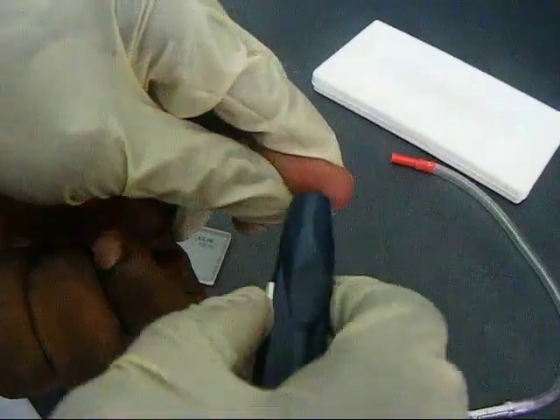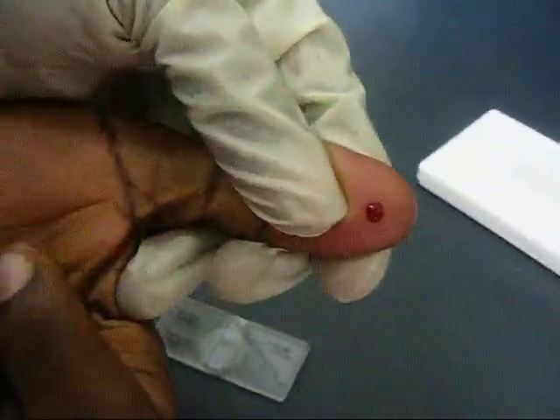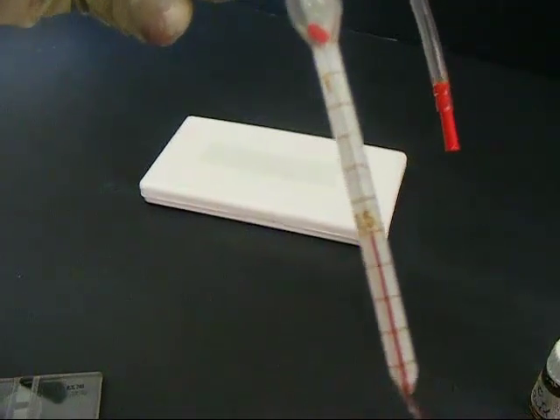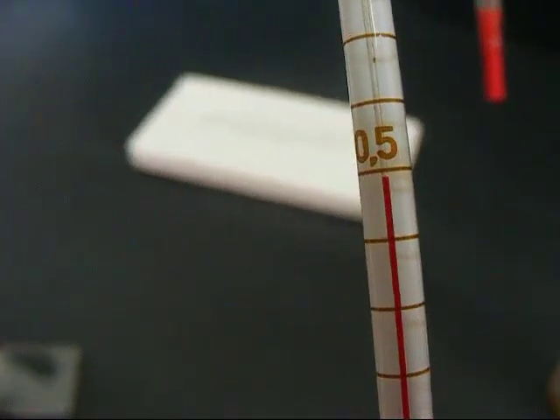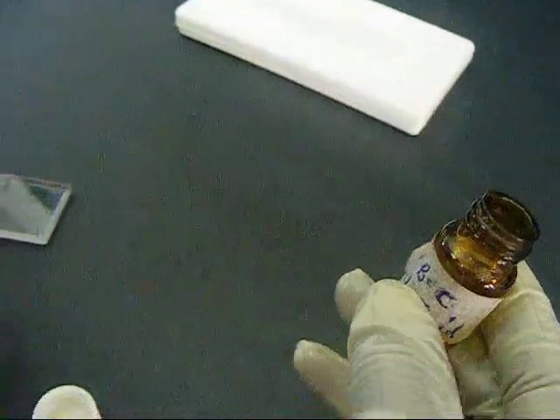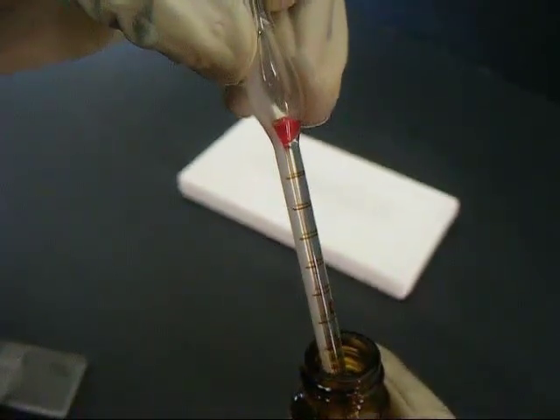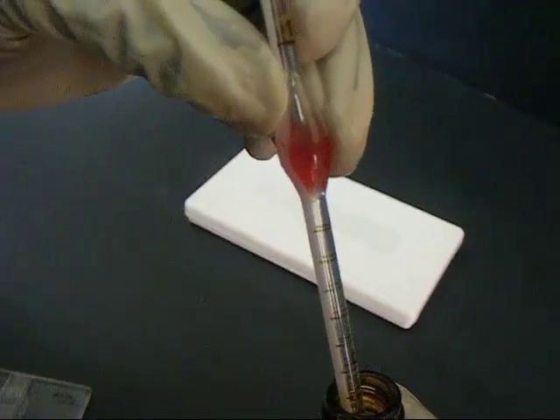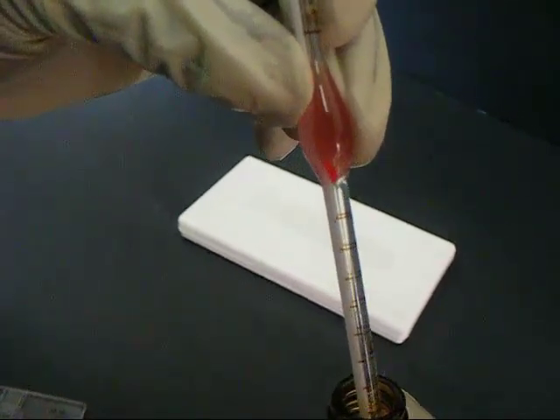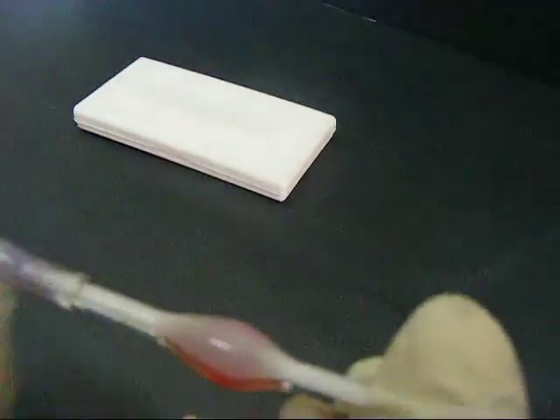The lancet is used to prick the tip of the thumb and the blood is pipetted with a red blood cell pipette and filled to the 0.5 mark. The pipetted blood is then diluted with Hayem's solution, that is the red blood cell diluting fluid, and filled to the 101 mark.